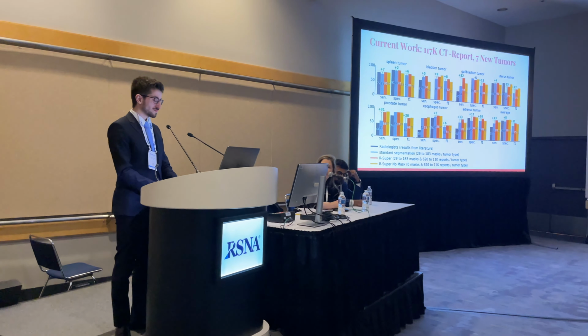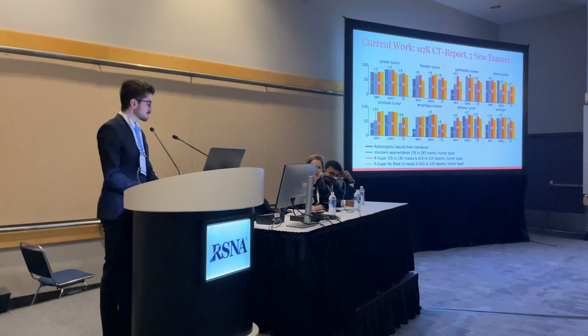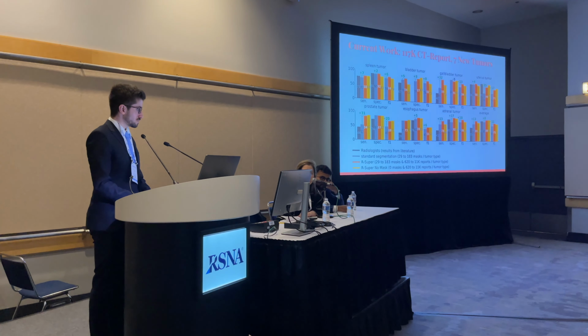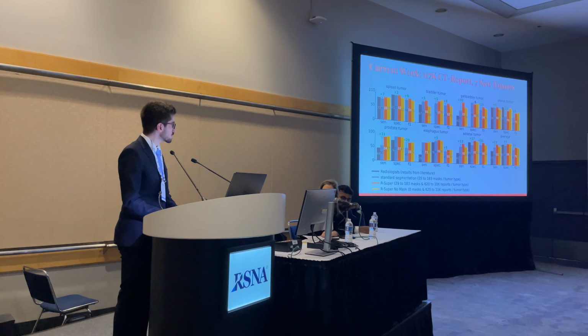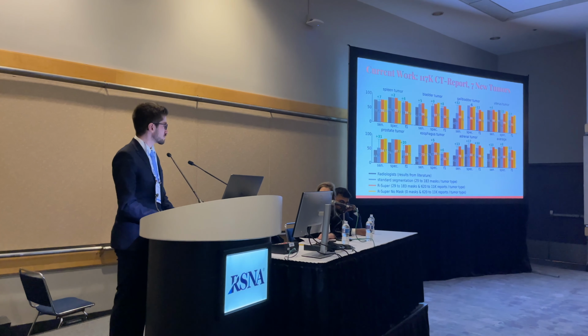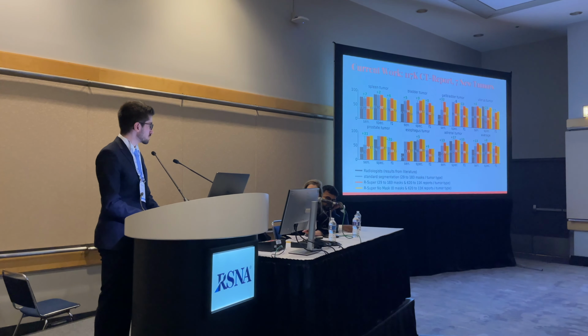Thank you. I had one question. Excellent work. I was just curious, I see on your last slide that you're using CT reports, but one of the tumor types you picked is prostate cancer. And it seems like prostate cancers are often difficult to see on CT, and you would prefer MR. So were these cases where the reader thought they could for sure see it and they measured it?